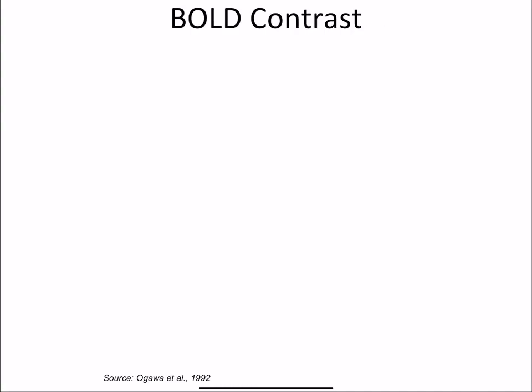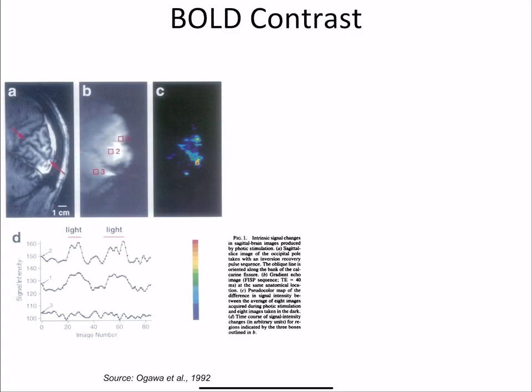Okay, so let's talk a little bit about BOLD contrast. BOLD stands for blood oxygenation level dependent. Let's just talk about what that contrast is.